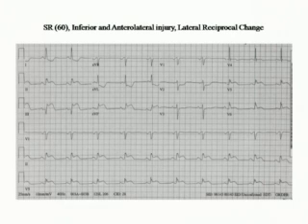Now, this is an example. But first, what's the mean electrical axis? Is it normal or abnormal? Yes, normal. And you can see after about the 10th tracing, with a little bit of practice, normal or abnormal will take you about a second, and getting to a number will take you about 3. So I'll point out here, we've got what appears to be ST segment elevation in 2, 3, and AVF, so evidence of inferior epicardial injury.